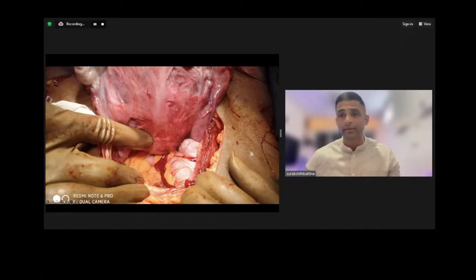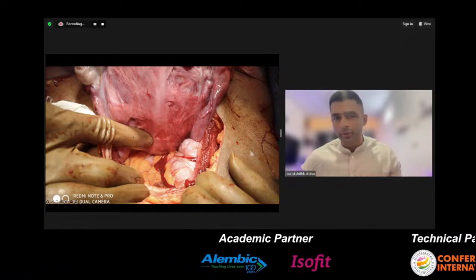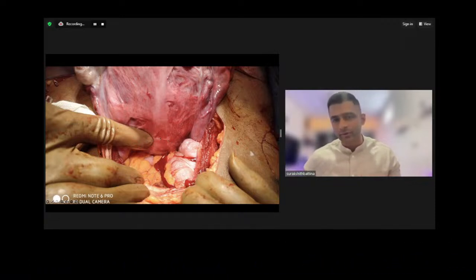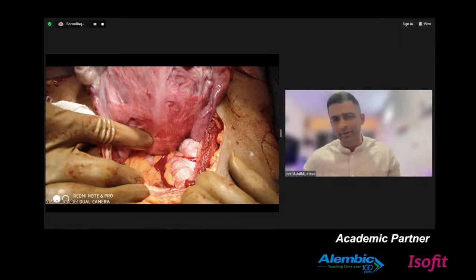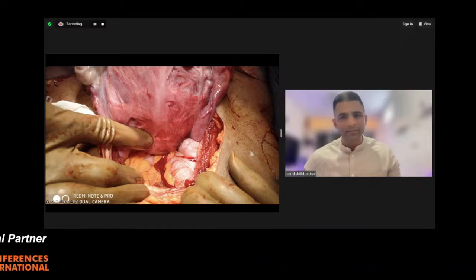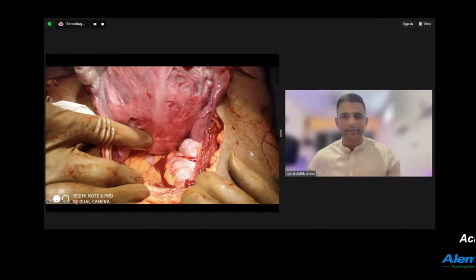So many of them say if the stitch is not working, or if in case you need to remove it, you can do a colpotomy and remove it. I don't think that is possible because you can see the stitch is deeply buried inside. Even though this bit is supposed to be exposed, you can see it gets buried inside the uterus. So you will be unable to remove the stitch once it's placed.